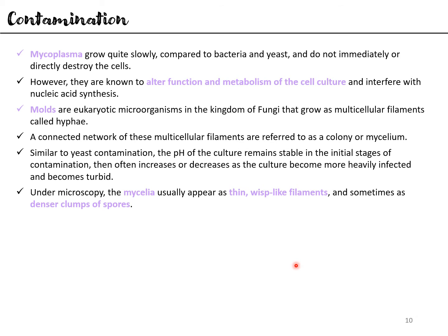Under microscopy, the mycelia usually appear as thin wisp-like filaments, and sometimes you can even visualize them as denser clumps of spores. Again, this would depend on what reproductive stage of the mold you're actually visualizing under the microscope.